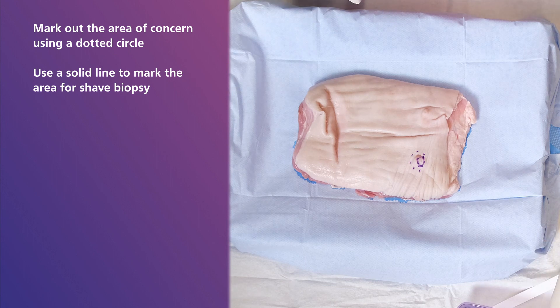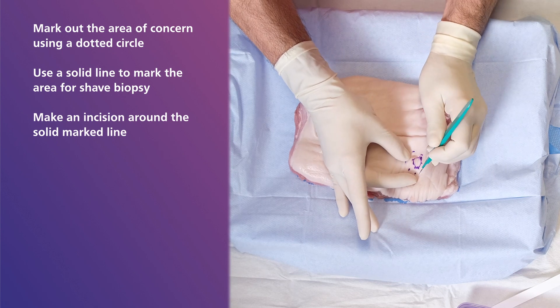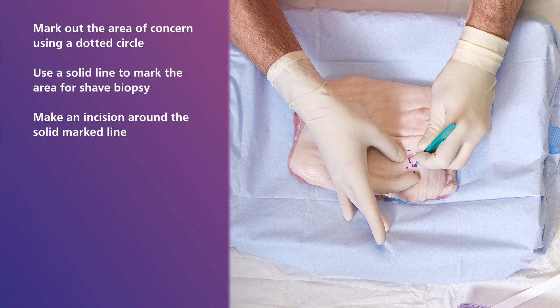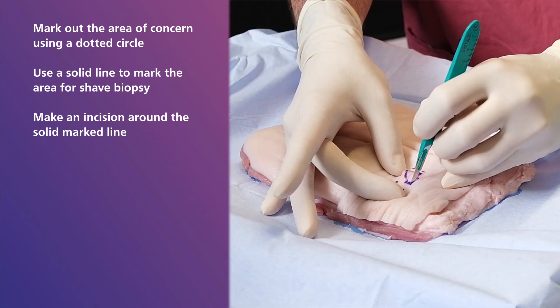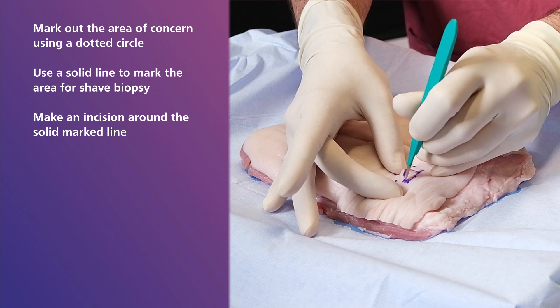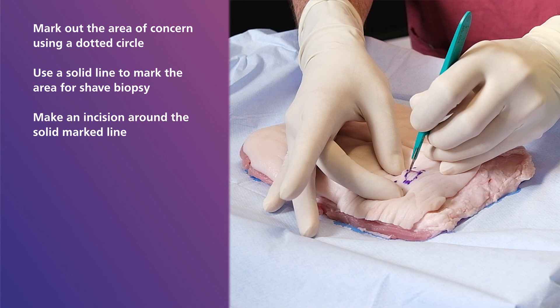Using a scalpel blade, make an incision around the solid marked line. In this instance it is best to use the scalpel in a mildly slanted position to achieve the depth required. Just a quick note here — the idea is to just score the skin and make a very shallow cut.